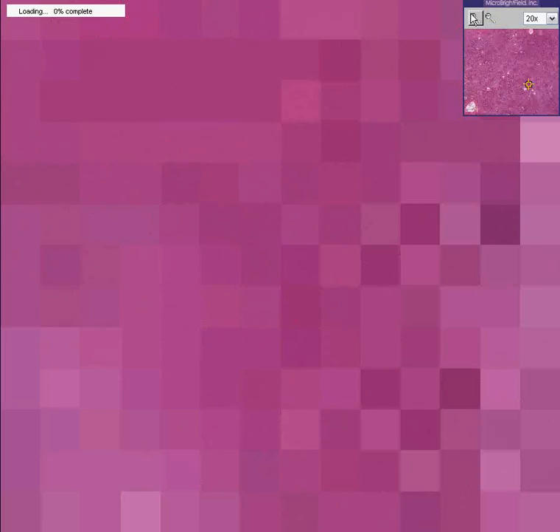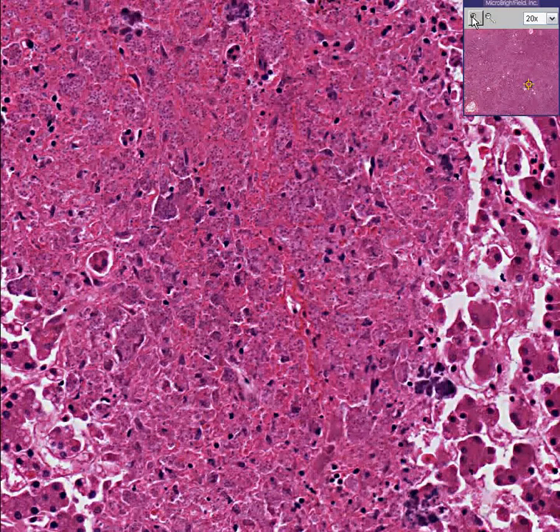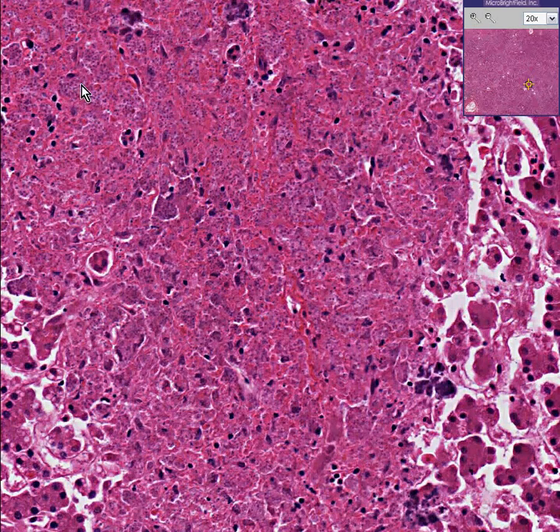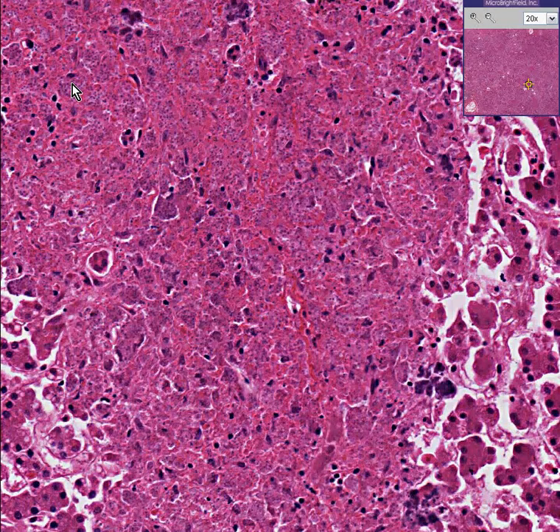Especially at the periphery of either bile ducts or hepatocytes. And what we might have to take a little bit on faith is that if you look at areas like this, that are a little bit purpler than usual — here or here or here or especially here — these are macrophages, or histiocytes if you prefer.